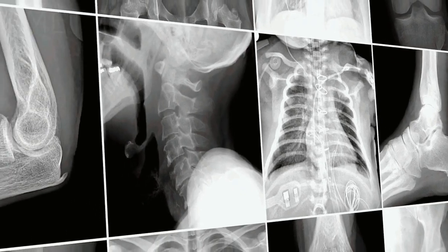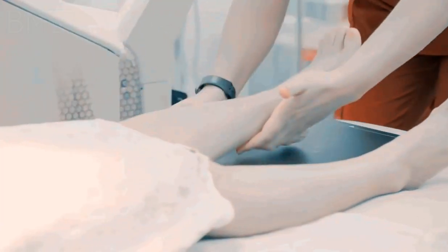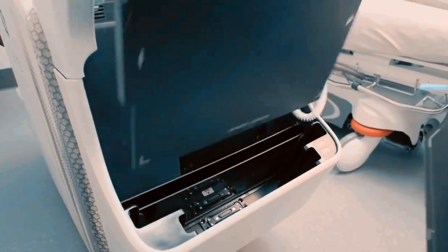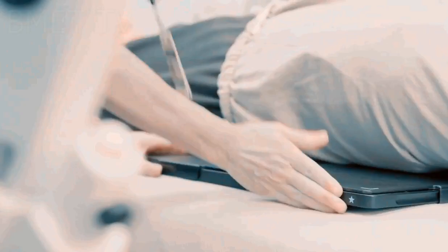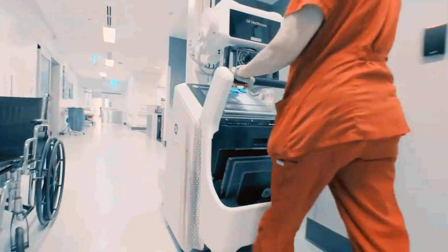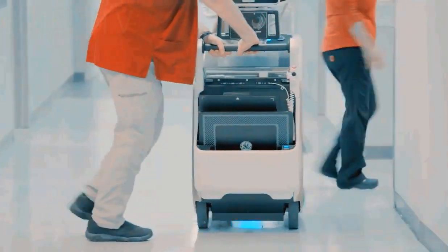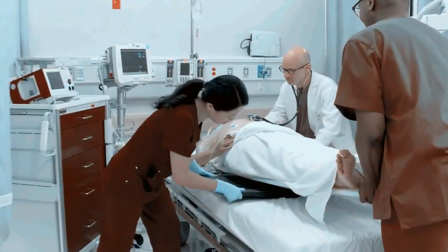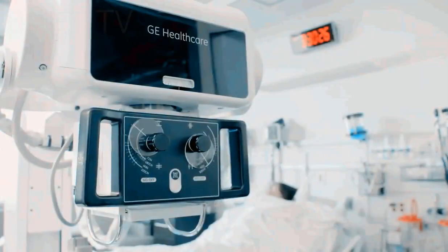Conventional radiology. This type of traditional X-ray produces a single two-dimensional image, which you have probably seen in an actual doctor's office, if not on a medical TV show or movie. Conventional radiology is primarily used for viewing bones, bone fractures, tissues dense in calcium, dental X-rays, and the chest. Because they are on conventional film, the doctor and patient must wait for the results. Today's digital images, like those produced by our digital cameras, are processed by a computer, so they can be viewed immediately. As a result, they are slowly replacing film.